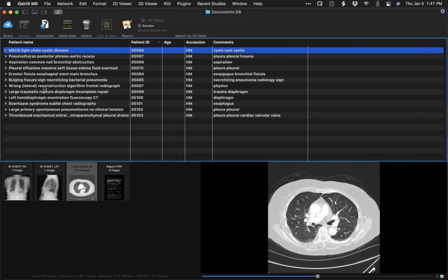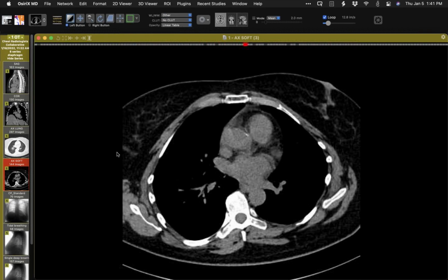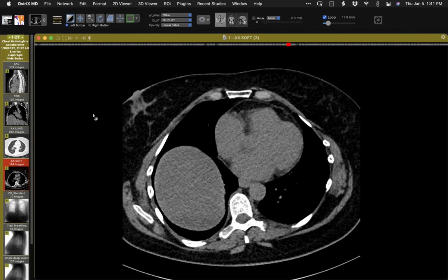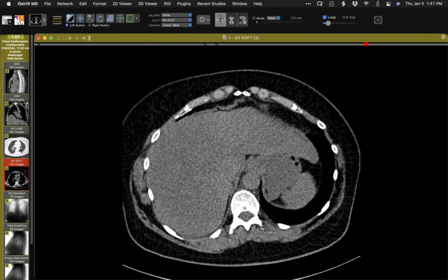Let me show you a case. Now, I've shown these before, but I want to show one again, particularly if there are trainees watching this, because there are findings here that can easily be misinterpreted, as occurred in this person. She was given the label of hemidiaphragm paralysis. So let me just get my timing right. This goes back to January of 2022, and you can see which part of the diaphragm is elevated back then.